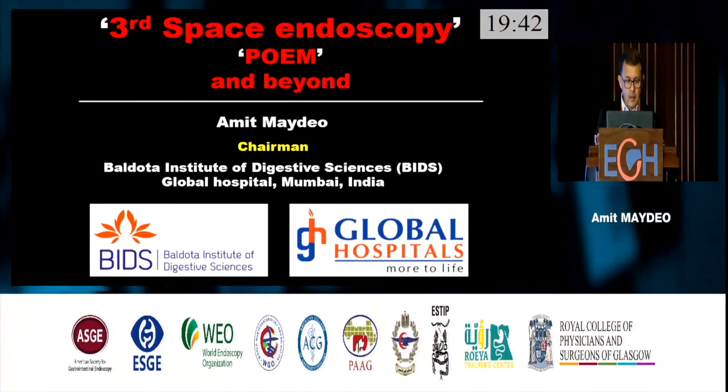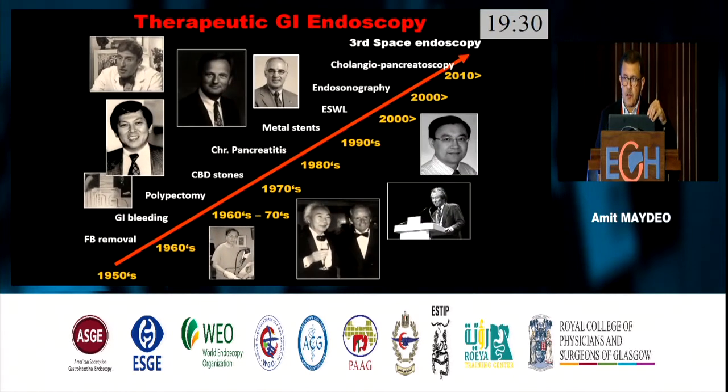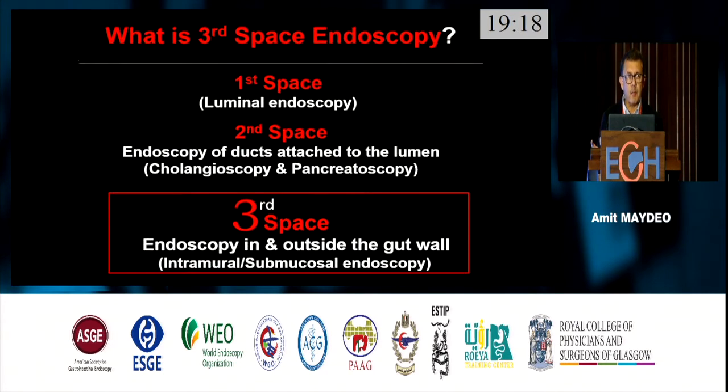which has taken the endoscopy community by storm over the last decade or so, and that is the invention and the practice of third space endoscopy. All of us know the immense advancement in interventional endoscopy, but this so-called third space endoscopy has been on the horizon only since the last decade. Now, what do we actually mean by third space endoscopy?